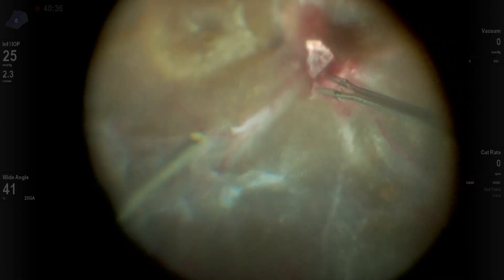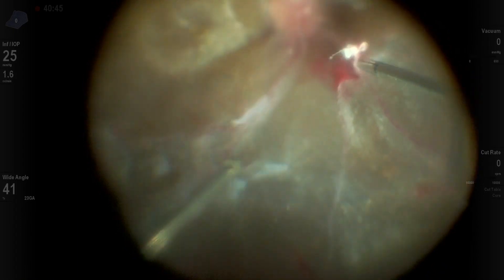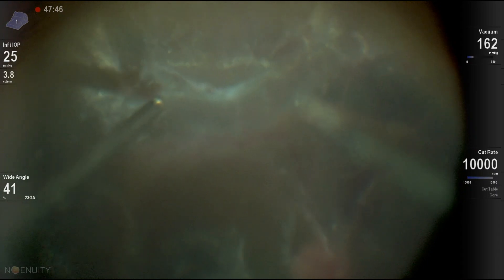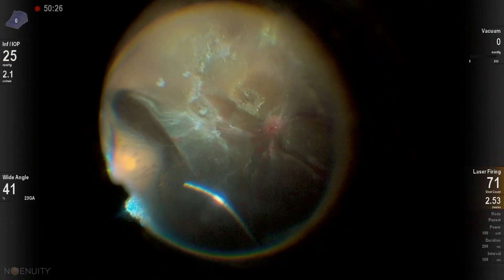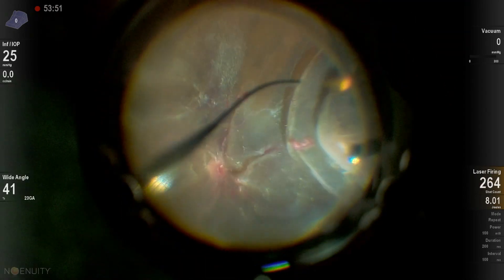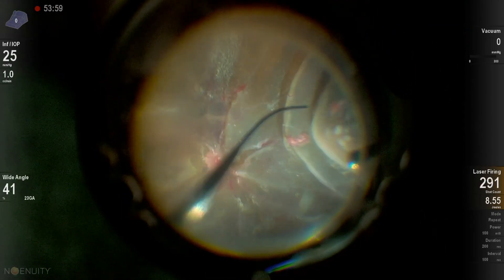Here removing some subhyaloid blood that was previously dissected. I'm finally finishing the peripheral vitreous, trimming what I've cut. Now here just indentation to look for breaks and some peripheral laser in the very periphery. You want to be cautious here not to do much laser in detached retina because you can pop the retina open.